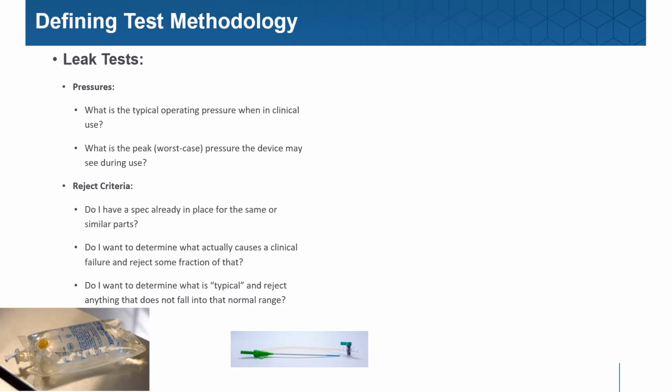Well, why is there a need to do that? Because a leak rate can be independent of the volume under test. This is not the same case with pressure loss. With pressure loss, if I have two items that are similar in construction, one is the size of a golf ball, the other the size of a hot water heater tank in your home, but they have the same shell or geometry or construction.